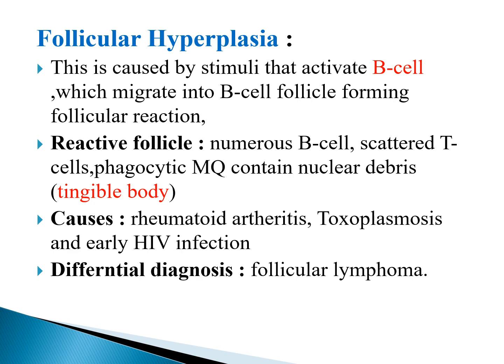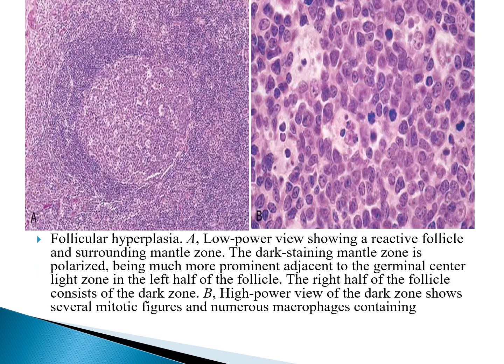Differential diagnosis: follicular lymphoma. Now, follicular hyperplasia. In slide A, a low power view showing a reactive follicle and surrounding the mantle zone.